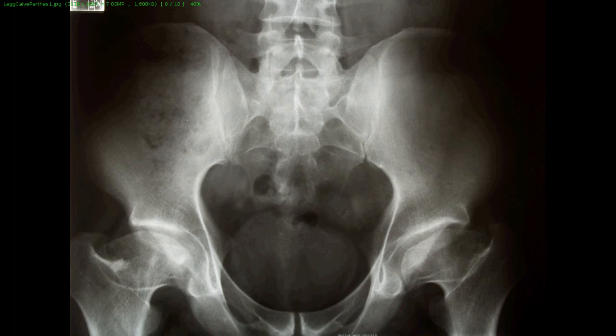In this particular instance, the flattening of the femoral heads and splaying of the femoral heads is more suggestive of Legg-Calve-Perthes disease. I would expect more of a medial slip of what were the femoral capital epiphyses from when this young man was a child, if I were to make that diagnosis. So I'm leaning more towards Legg-Calve-Perthes disease in this case. The sclerosis of the acetabular roofs is consistent with early degenerative joint disease in this case, and the changes at L5S1 are congenital anomalies unlikely to be clinically significant, although there may be some biomechanical changes at that level.